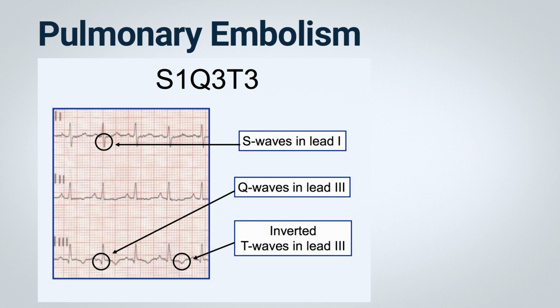While the presence of these changes, particularly in combination, can suggest pulmonary embolism, they are not definitively diagnostic. Many patients with substantial pulmonary emboli may display only minor, relatively nonspecific ECG changes. Consequently, both the diagnostic sensitivity and specificity of the ECG for pulmonary embolism are limited. These findings may also arise from other causes of acute or subacute right ventricular overload, cor pulmonale, such as severe pneumonia or widespread pulmonary malignancy.